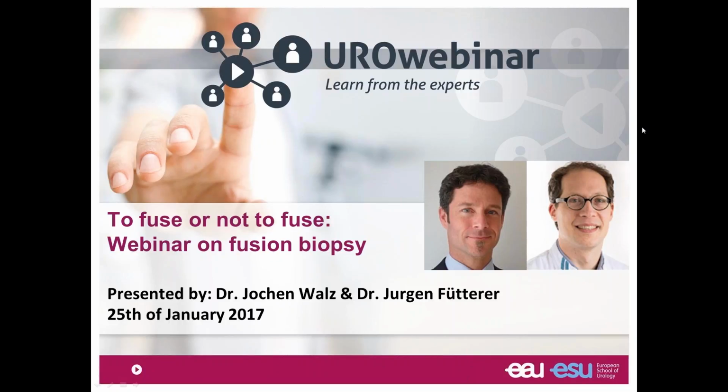Actually, the transperineal approach often needs a little bit more sophisticated anesthesia. It can be done under local anesthesia, but sometimes it's done in sedation, sometimes even under general anesthesia. So you need to weigh the advantages and the disadvantages.